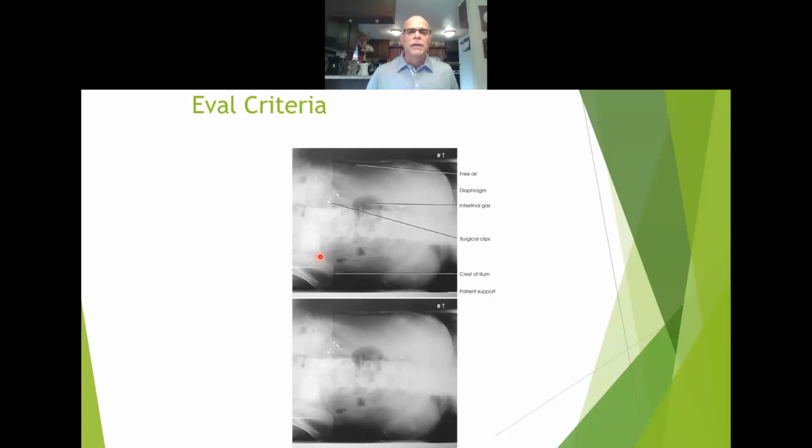So if they're laying on their left side, what big organ is taking up this spot right here? The liver. So your air is going to be able to accumulate quicker because this is a big solid mass right here, and they're on their left side. And you can see just at the margin right here, this little gray area, that's the mattress pad. So you've gotten the iliac wing and all that lifted up, so you're seeing the entire area of the abdomen. These are obviously surgical staples, diaphragm. There's your iliac crest.